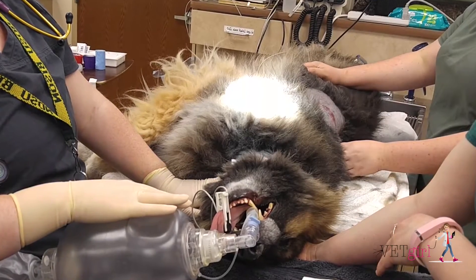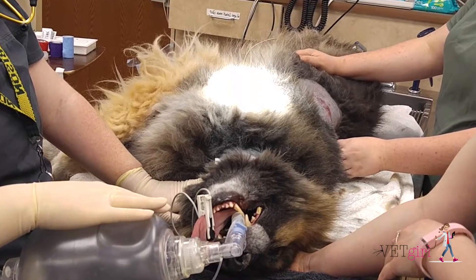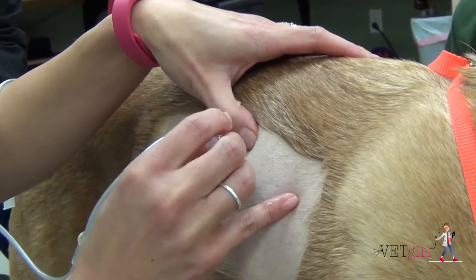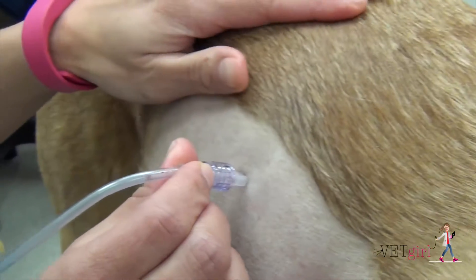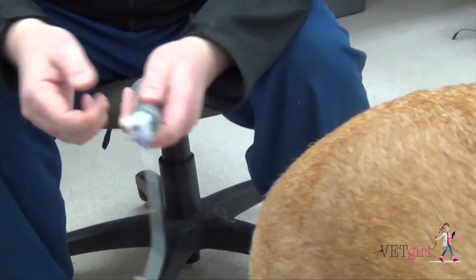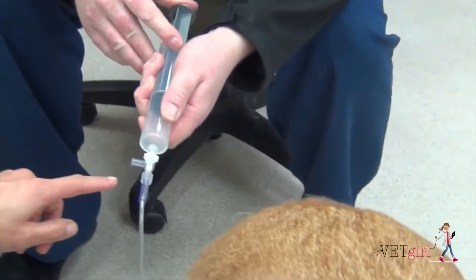In this VetGirl video, we demonstrate how to perform an autologous blood patch pleurodesis for treatment of pneumothorax in a dog. While pneumothorax is often treated by thoracocentesis, chest tube placement, or rarely surgical correction, the use of an autologous blood patch can be considered for those that have failed conservative therapy or may not be a surgical candidate.